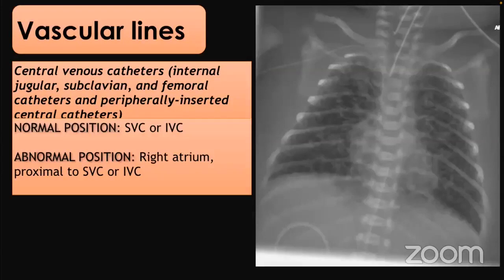After that, we will go to the vascular lines. The normal position may be in the superior vena cava or inferior vena cava.